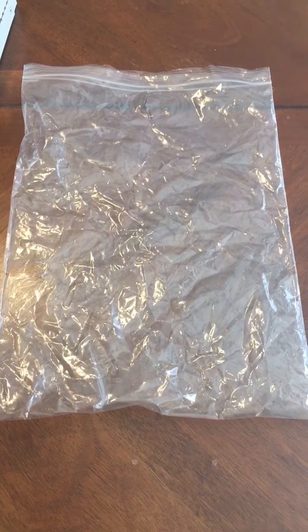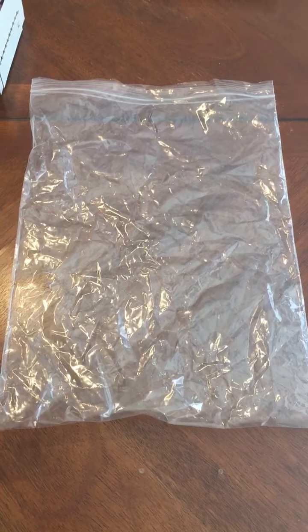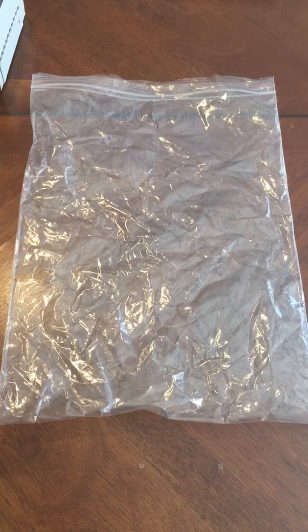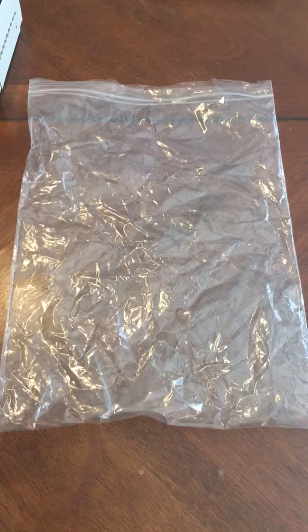This video covers the do-it-yourself pump bag. You would use this if you are seeing a patient who doesn't have a pump clip or fanny pack to hold the pump on the pole.